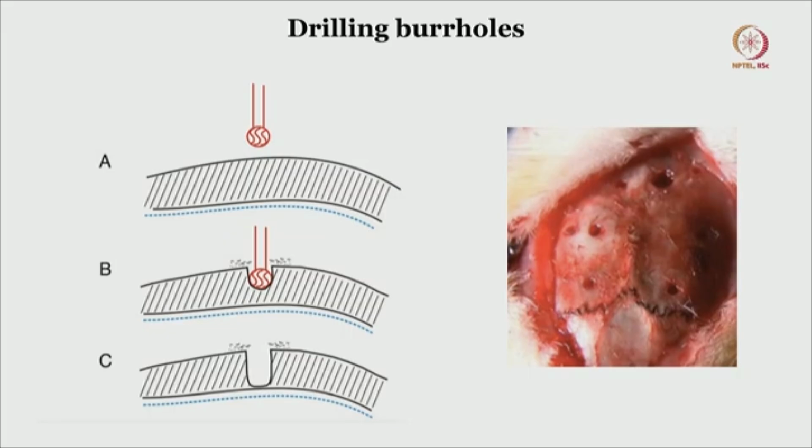You can even use the needle to puncture the papery inner table. If it is thin enough, you can even break it with the needle, but never puncture it or plunge it with force, because that is going to damage your cortical targets, which is very detrimental, and you will probably have to abandon the experiment if there is a plunge of the drill inside the brain. So, that is the reason I kept re-emphasizing to use the cadaveric rat models if you are a beginner, to practice these steps.